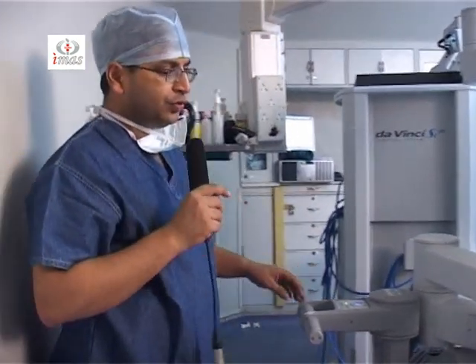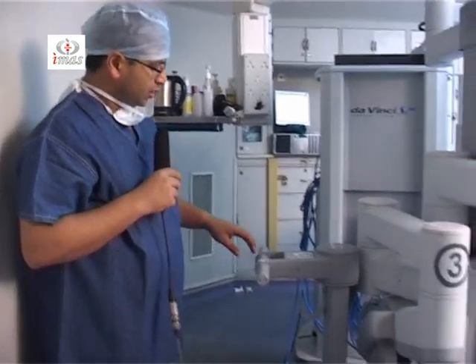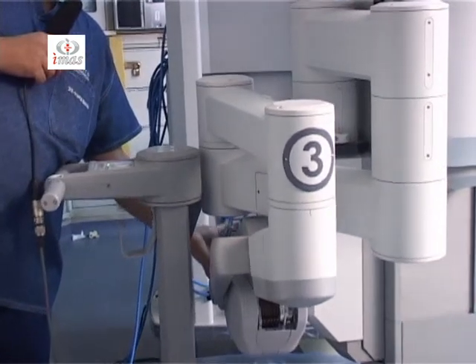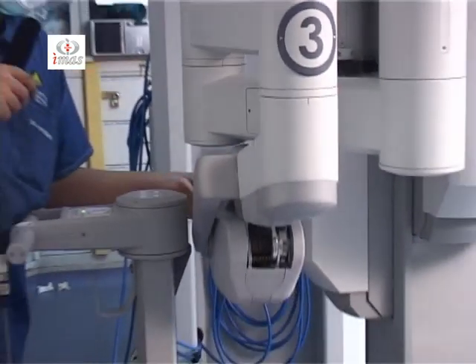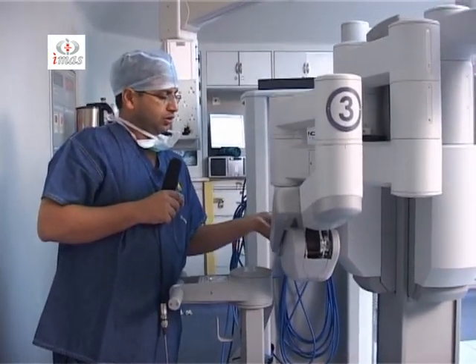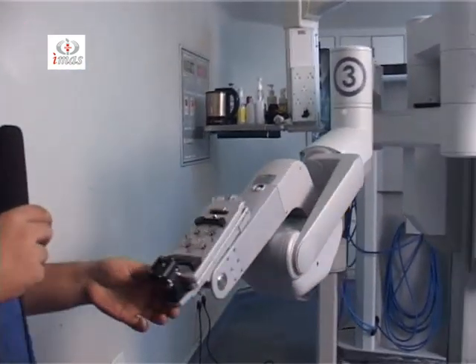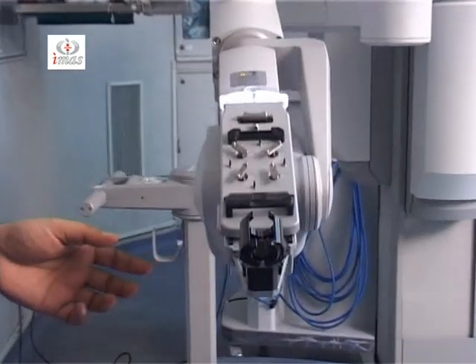So this is the stored position of the third arm, and now to take it out, you just have to press the port clutch again. Remove the arm like this, and it will automatically open up.